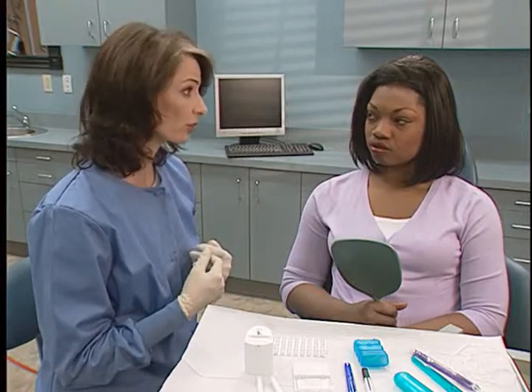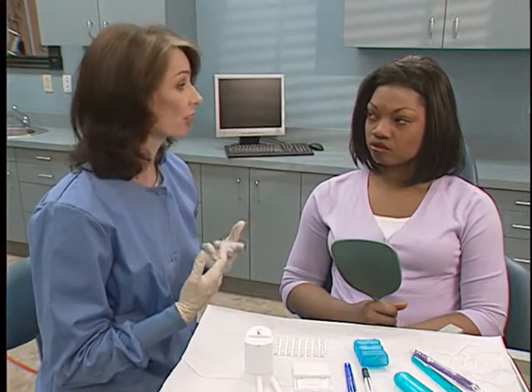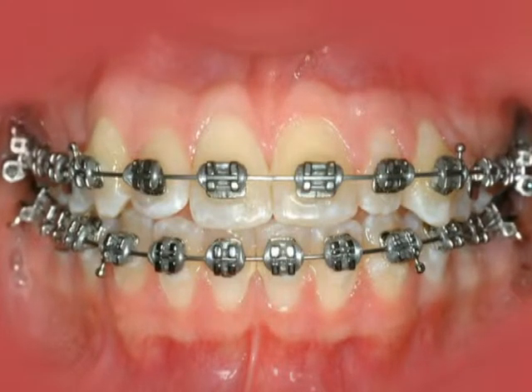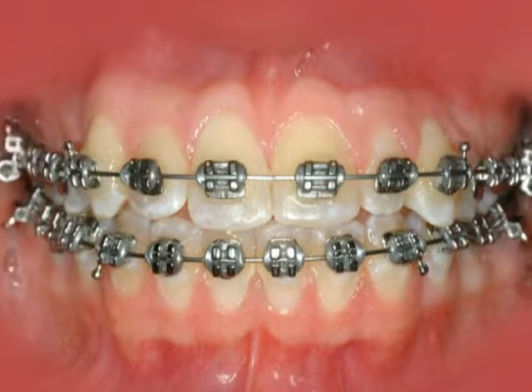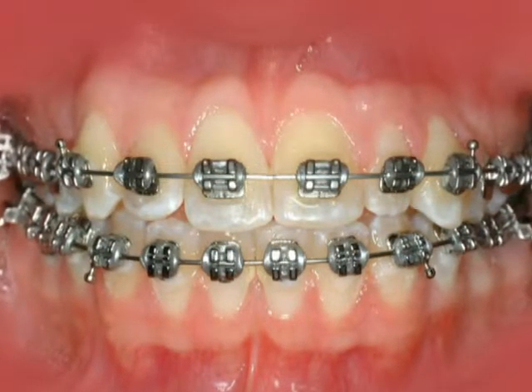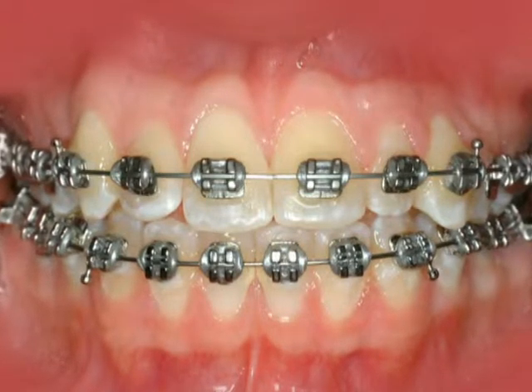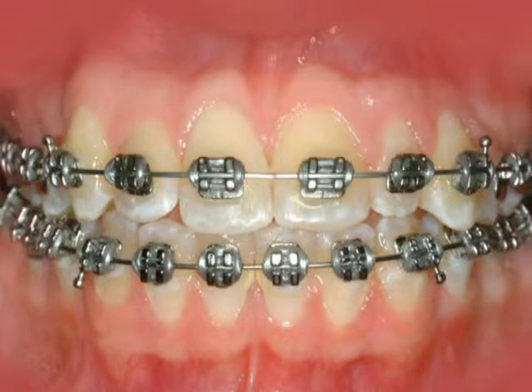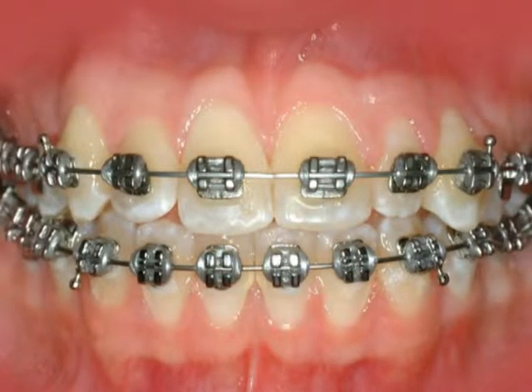You may find you need to brush again if there are some areas that you've missed. A good way to tell if you're brushing correctly is if your braces look clean and shiny and you can see the edges of the brackets clearly. This is a good time to check for loose or broken brackets. If you find a problem, call the orthodontist's office to see if it needs to be checked out and if extra time needs to be scheduled to make the repair.